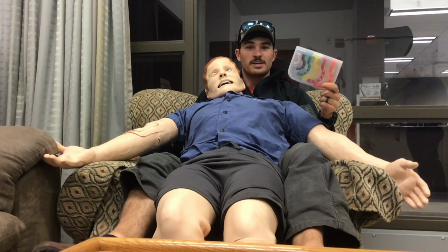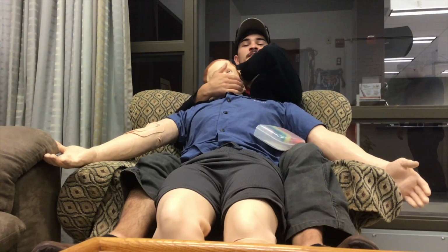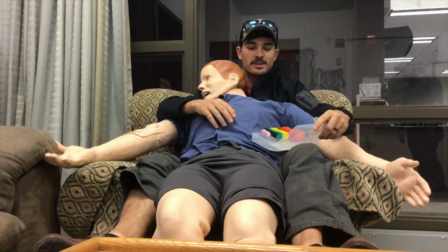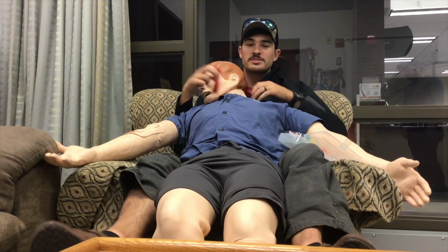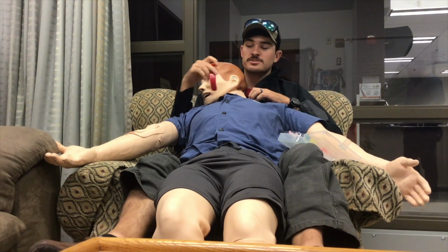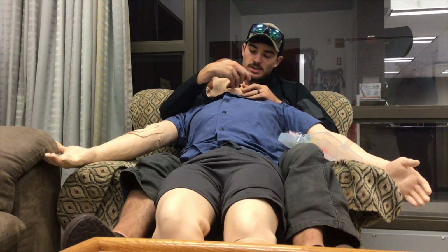So to use OPAs, we need to measure from the tip of the mouth to the tip of the ear. So hang on, just turn them here. So we measure, you get your oral adjunct, your OPA, and measure from the tip of the ear to the tip of the mouth. And when we insert these, we don't insert them straight down. We insert them at either 90 degrees or 180 degrees.